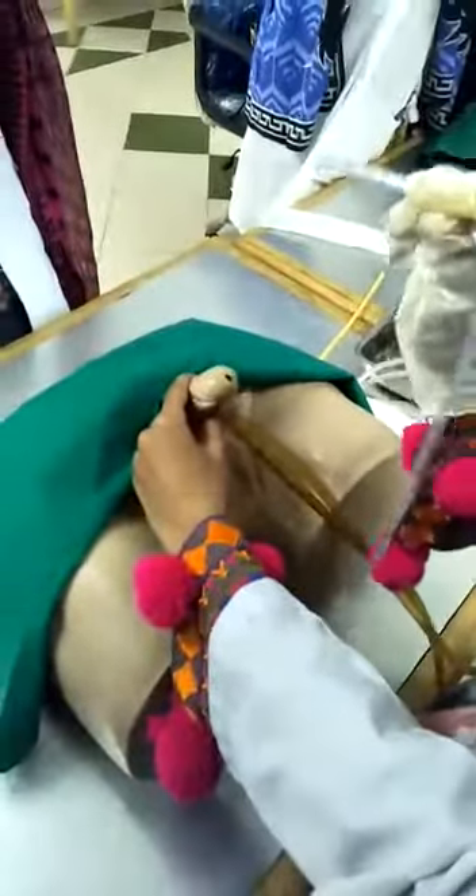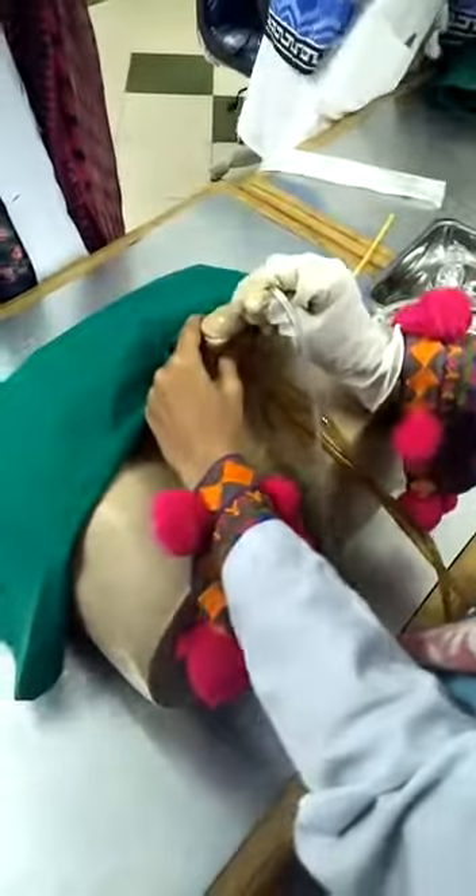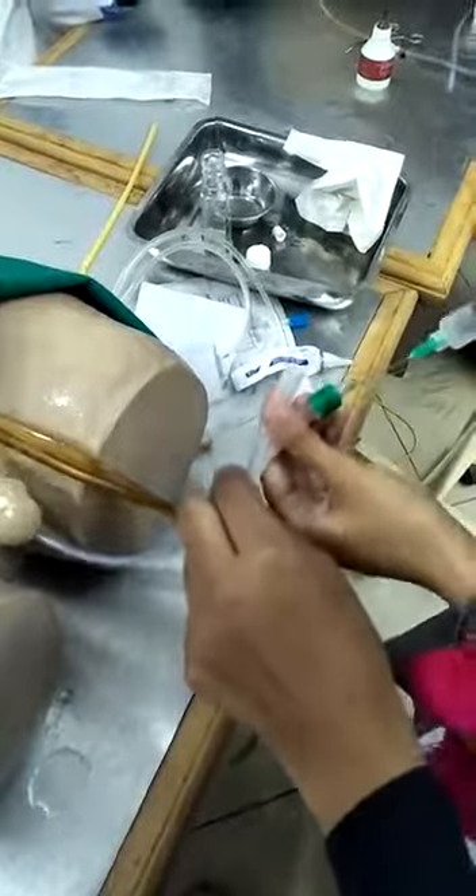Then hold the penis with the non-dominant hand in the perpendicular direction and insert the catheter with the dominant hand. Insert it up till the bifurcated point. Then insert — urine drainage begins, which means that the catheter has reached the right place.